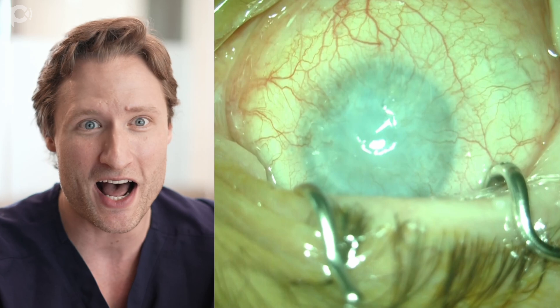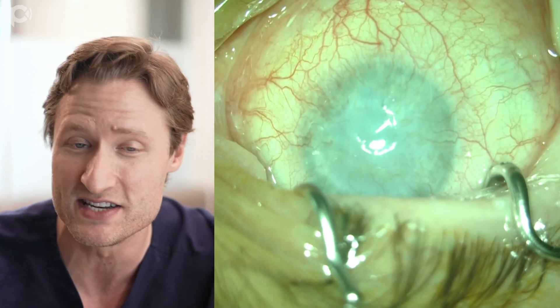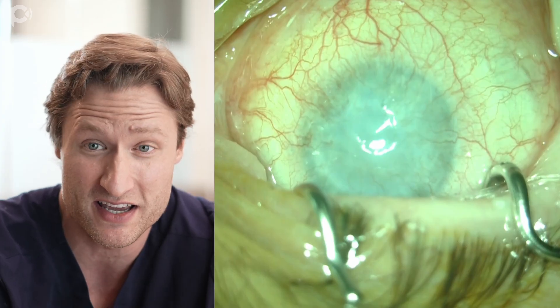What options do you have to fix this? Another PK is definitely not going to work - he's going to reject that immediately from how densely vascularized this transplant is.